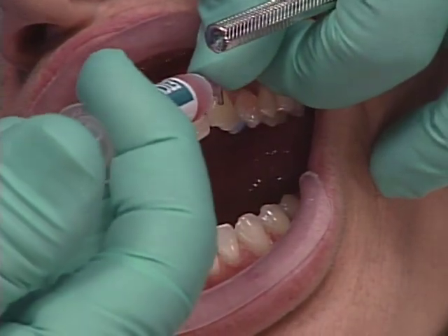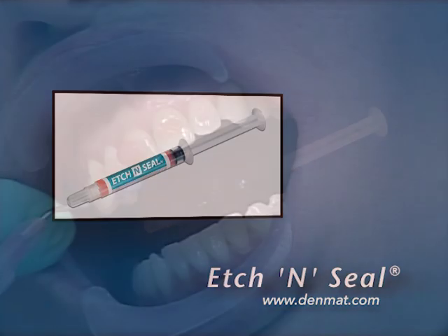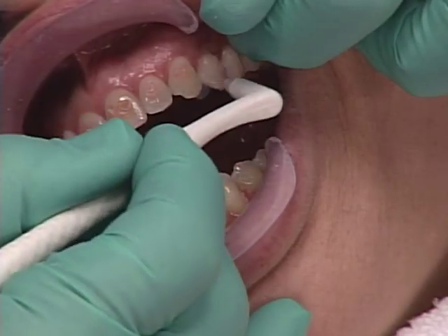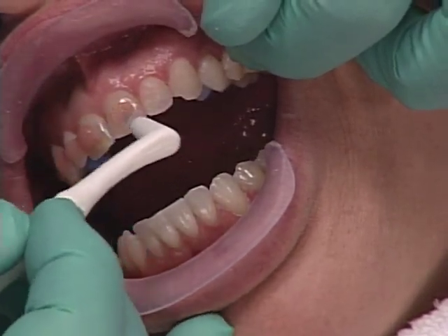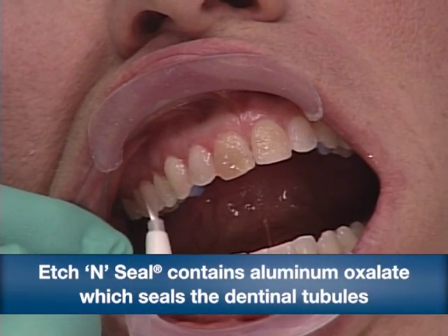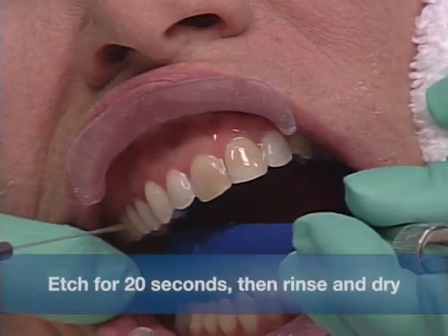I'm putting on Etch N Seal. Etch N Seal is phosphoric acid, medium viscosity, and that way I can push it around with the brush and control where I want it placed. And it contains aluminum oxalate. The reason it has aluminum oxalate is because the oxalate will seal the dentinal tubule.